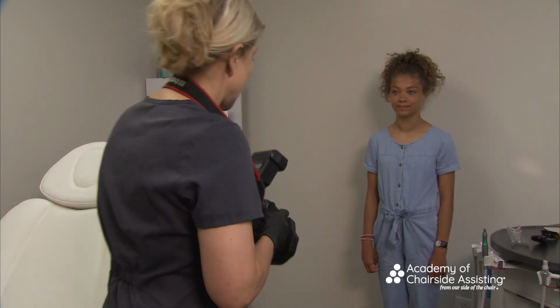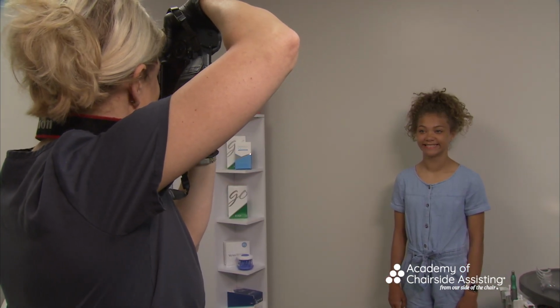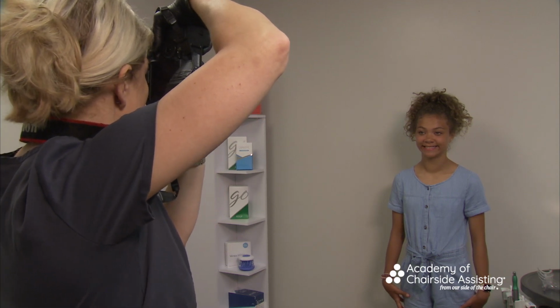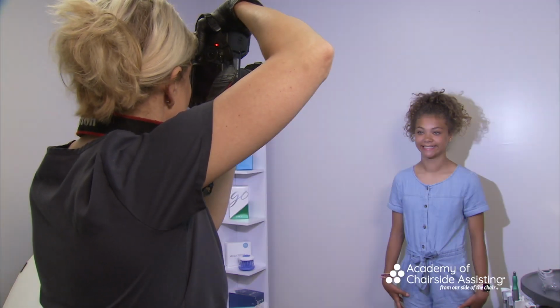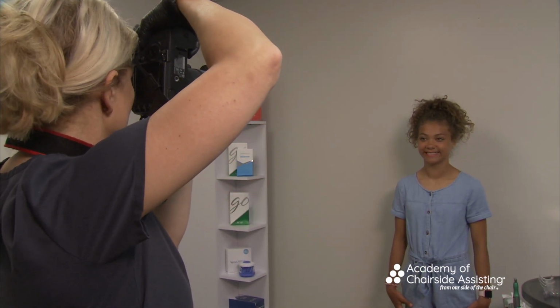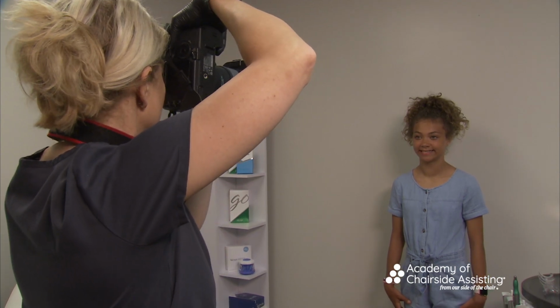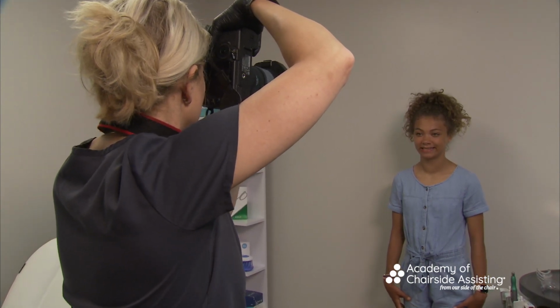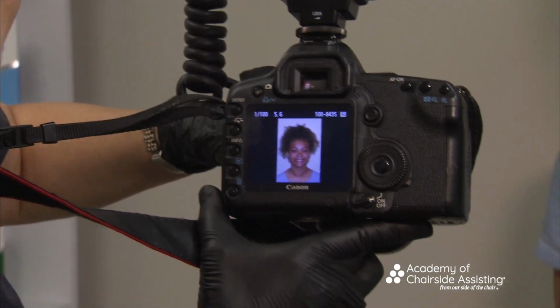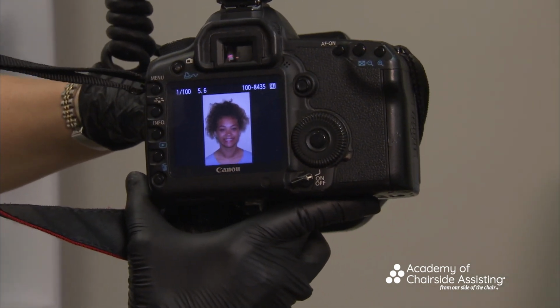And I'm going to back up, and I am going to, again, turn my camera straight up, get her right in the frame, moving my body. Remember, we're not touching the dial, okay? Beautiful. I'm going to take one more, only because I just want to get a little bit closer in case he wants it. Listen for the beep. Notice here, I'm going to show the camera, I really like this photo better than the horizontal. I always feel like I cut the top of the hair off.